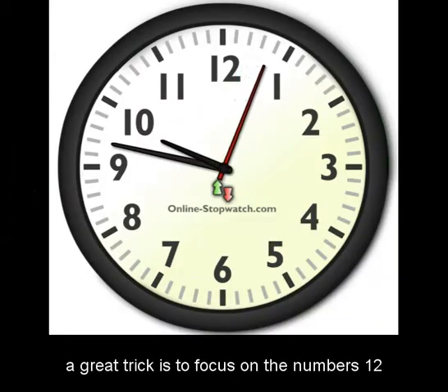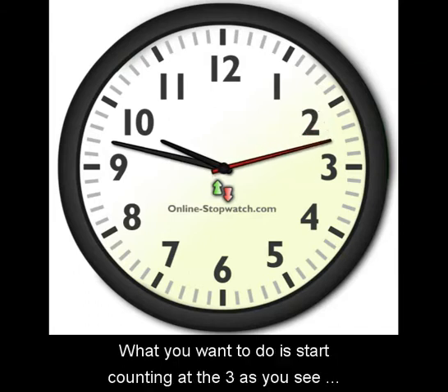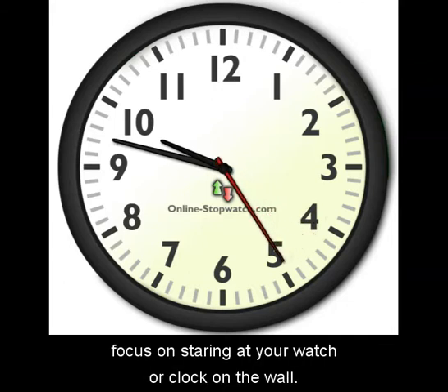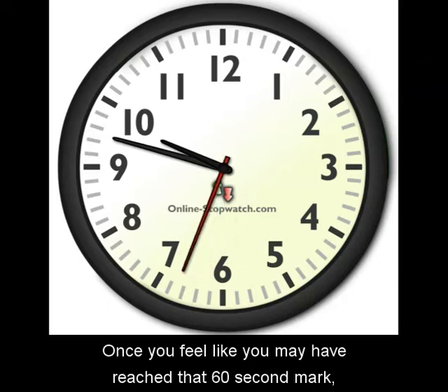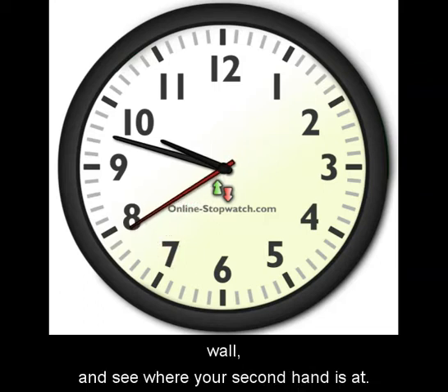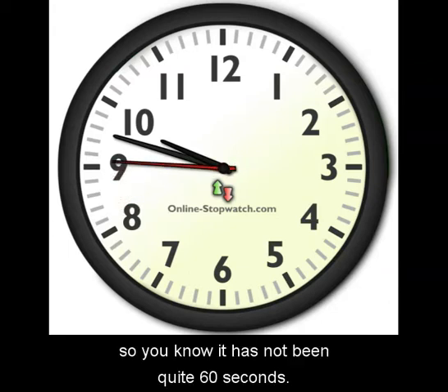If you're new to this, a great trick is to focus on the numbers 12, 3, 6, and 9 on your watch or clock in the office. Start counting at the 3 as it just passes, and focus on the sound — do not focus on staring at your watch or clock. Listen to the sound of the lub-dub. Once you feel like you may have reached that 60-second mark, glance at your watch or clock and see where your second hand is.